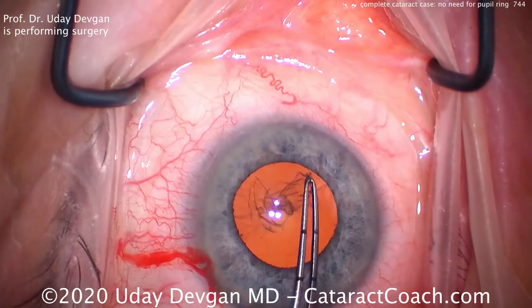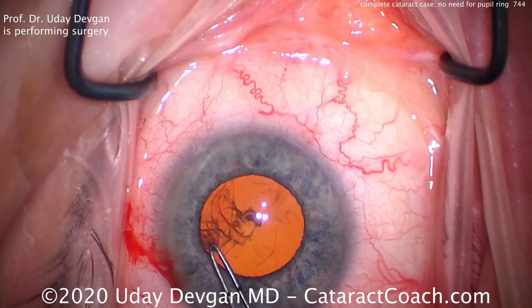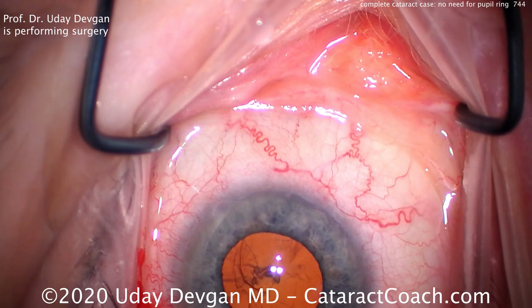You'll see it doesn't look like much of a cataract now because the red reflex is so bright. But as we start to chop this nucleus, you'll be able to determine the level of nuclear density. That looks very nice.